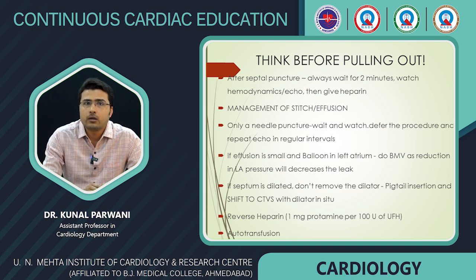If the balloon has been advanced, you may complete the procedure of the BMV if the patient is hemodynamically stable. And if the septum is dilated, don't remove the dilator. Keep the pigtail in the LA and shift the patient to the CVTS with the dilator in the LA. Reverse the heparin with protamine, and also you can do autotransfusions.